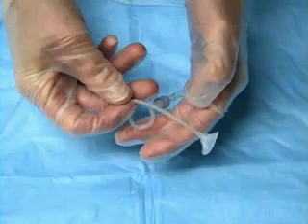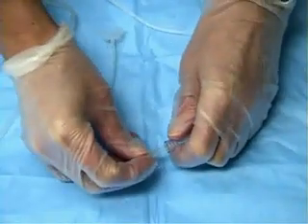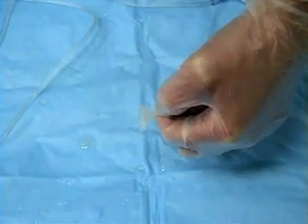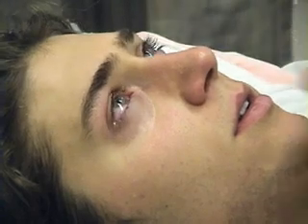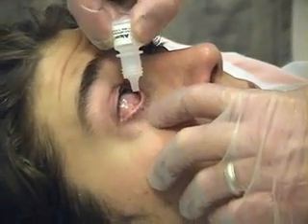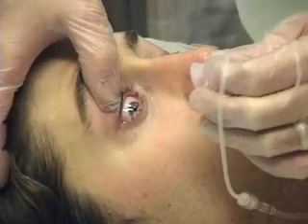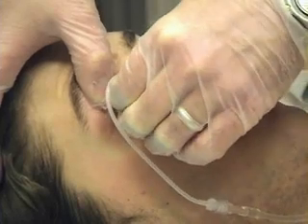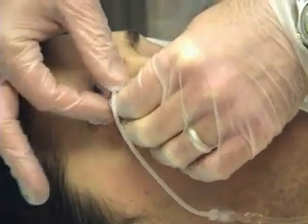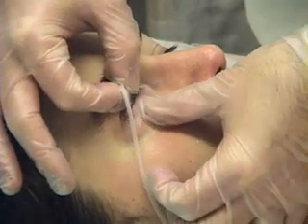The Morgan lens may be used in cases where prolonged irrigation is required. Attach the lens to the saline tubing, then open the wheel clamp so fluid flows through the device. Remember to apply a topical anesthetic to the eye prior to insertion of the lens. Instruct the patient to look downwards and insert the lens under the upper eyelid. Next, ask the patient to look upward and insert the other half of the lens under the lower eyelid.